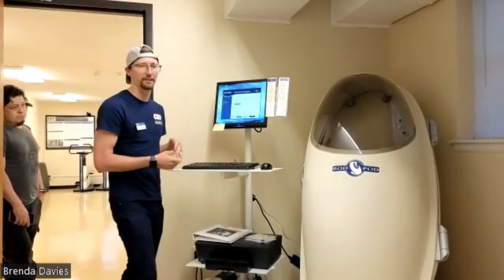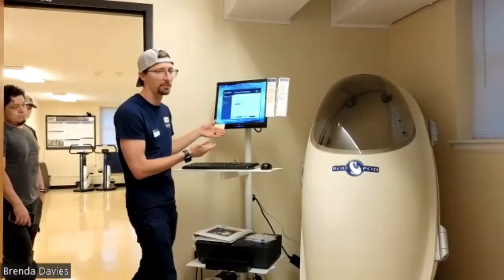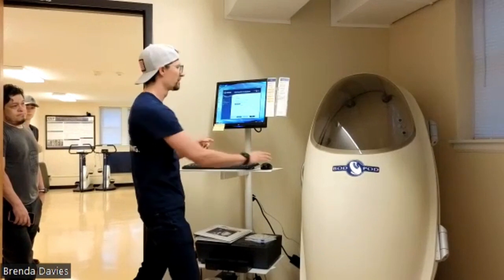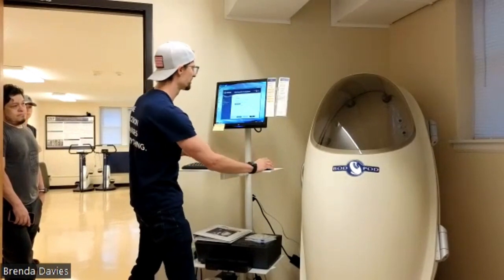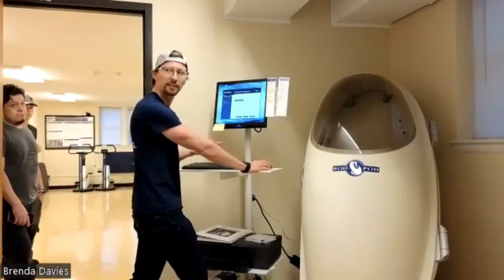What you do, if you know how to read, this is a really easy assessment to do. Basically, just follow the prompts and make sure that the individual is completing prompts in the order that they come at you.